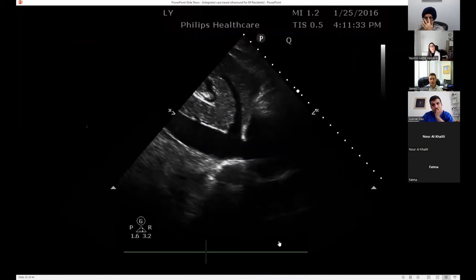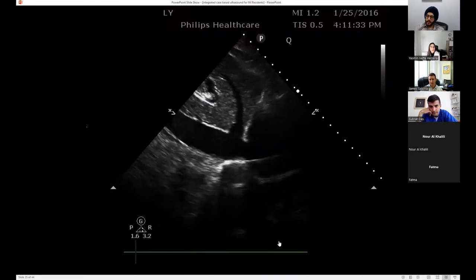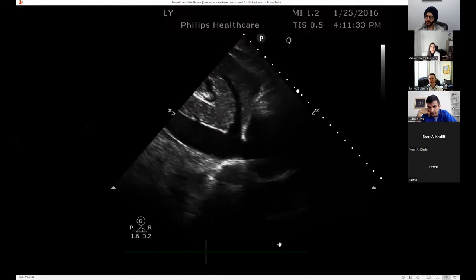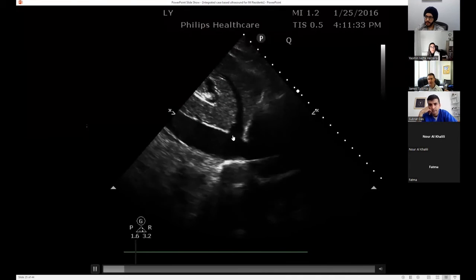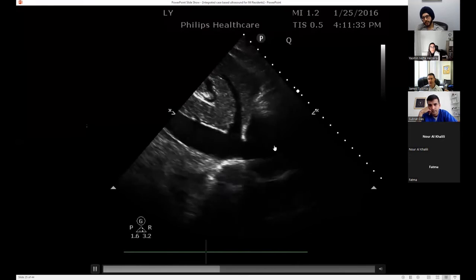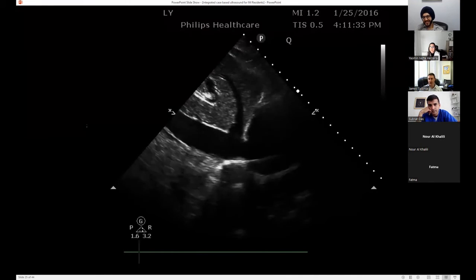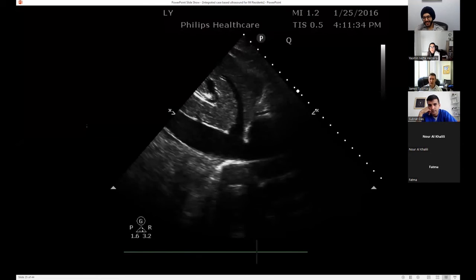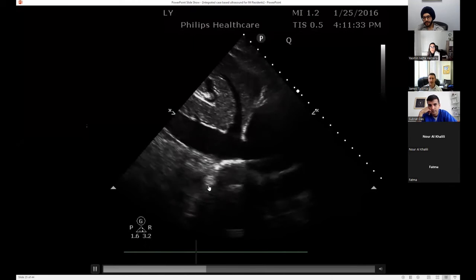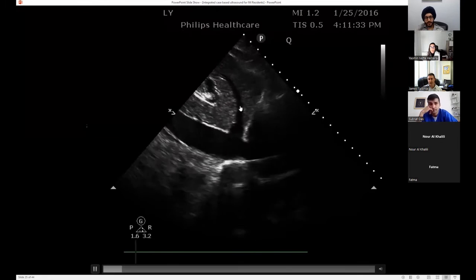What do we have here? Dilated IVC and non-compressible. Good. And so this is just for anatomy, perfect view of the IVC, hepatic vein. This is what you want to see, it entering into the RA. You don't want to make the common and fatal mistake of finding the aorta, like many people do, and say, hey, look how big that is, right? Everyone's hypervolemic, everyone's volume overloaded, everyone's CVP is through the roof. These structures are right next to each other, and you're easily able to misidentify them. So you want to see those typical features.